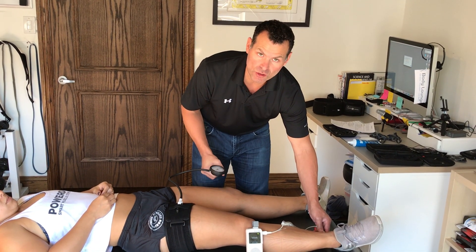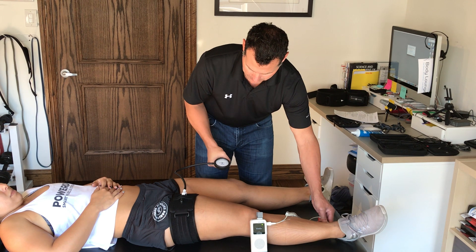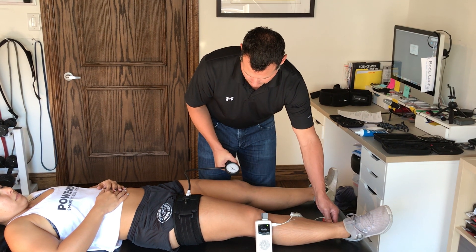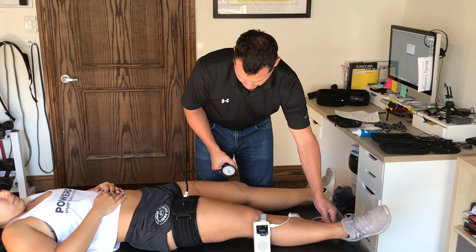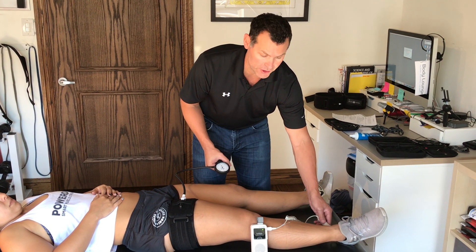Now I'm going to inflate until I no longer hear that pulse. And there — I no longer hear the pulse and it's at 140 millimeters of mercury. I'll turn off my ultrasound.